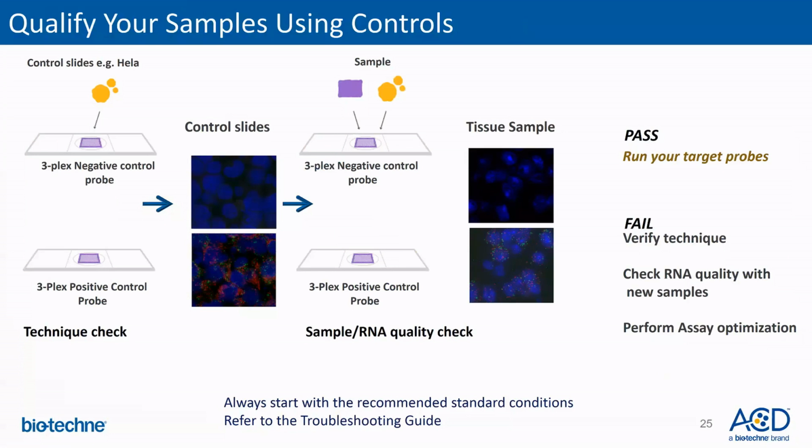Once you have verified your technique, you can then proceed to use control probes and quality check your sample and RNA. In this case, for the tissue sample, we are looking at fresh frozen human brain. Again, for the negative control, you're seeing only the nucleus stain, and for the positive control, you can see RNA staining as punctate dots.